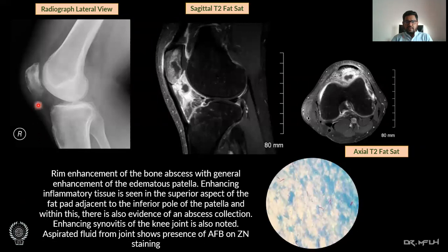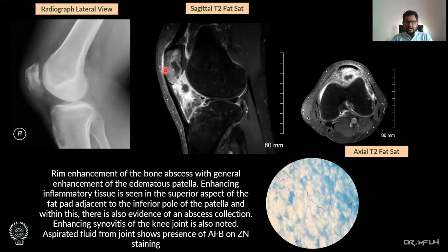Here we can see a lateral knee radiograph showing an osteolytic lesion, and rim enhancement of the bone abscess with general enhancement of the edematous patella on sagittal T2 fat-sat imaging. Fluid aspirated from the knee joint and subjected to acid-fast bacillus staining shows multiple acid-fast bacilli.